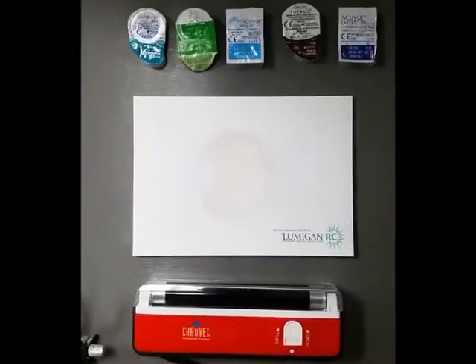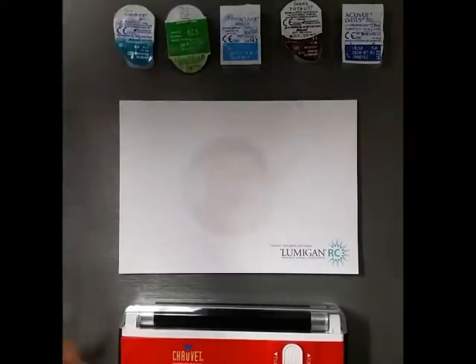Hi there. Today's video we're going to test some contact lenses and see which ones protect you from UV exposure. That's right — UV protection on your contact lenses. They're not all the same, so we're going to take a look at some leading one-day and reusable contact lenses and see which ones provide you with the best UV protection. This should be fun.